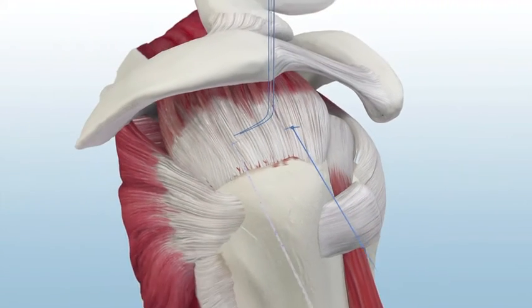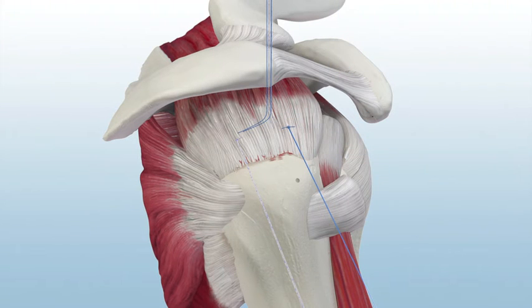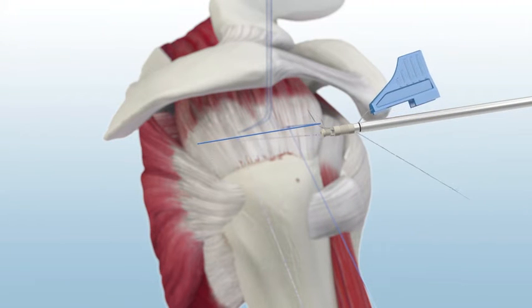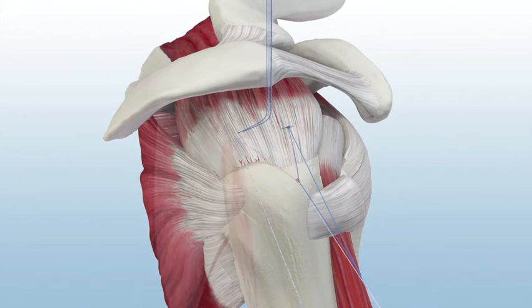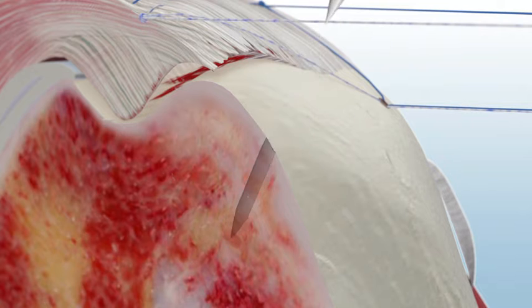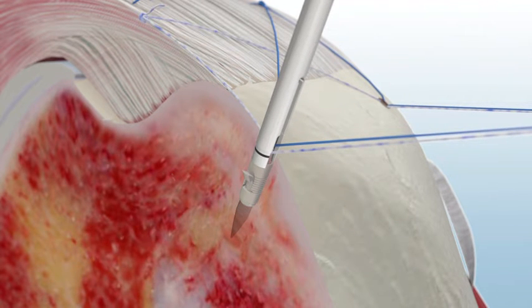Next, a Poplok punch is used to create a pilot hole for the first lateral suture. 1 suture tail from each knot is loaded into a 4.5 Poplok anchor, and the anchor is fully seated in the pilot hole. After tensioning the suture, the anchor is deployed. This process is repeated for the second Poplok anchor. The suture tails are left uncut.